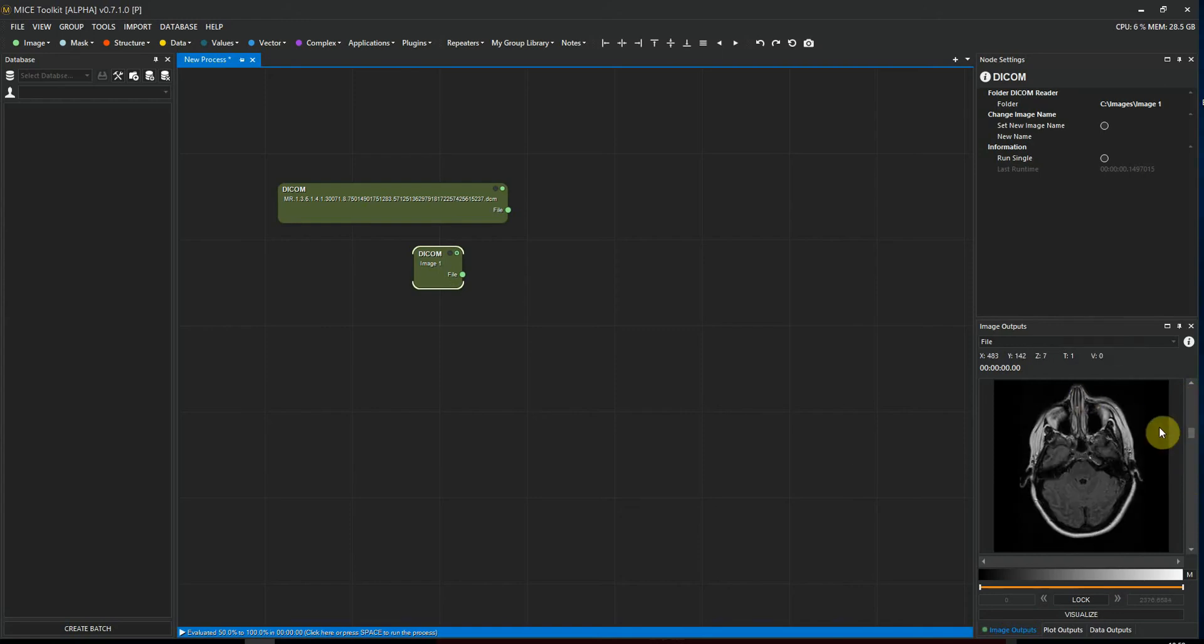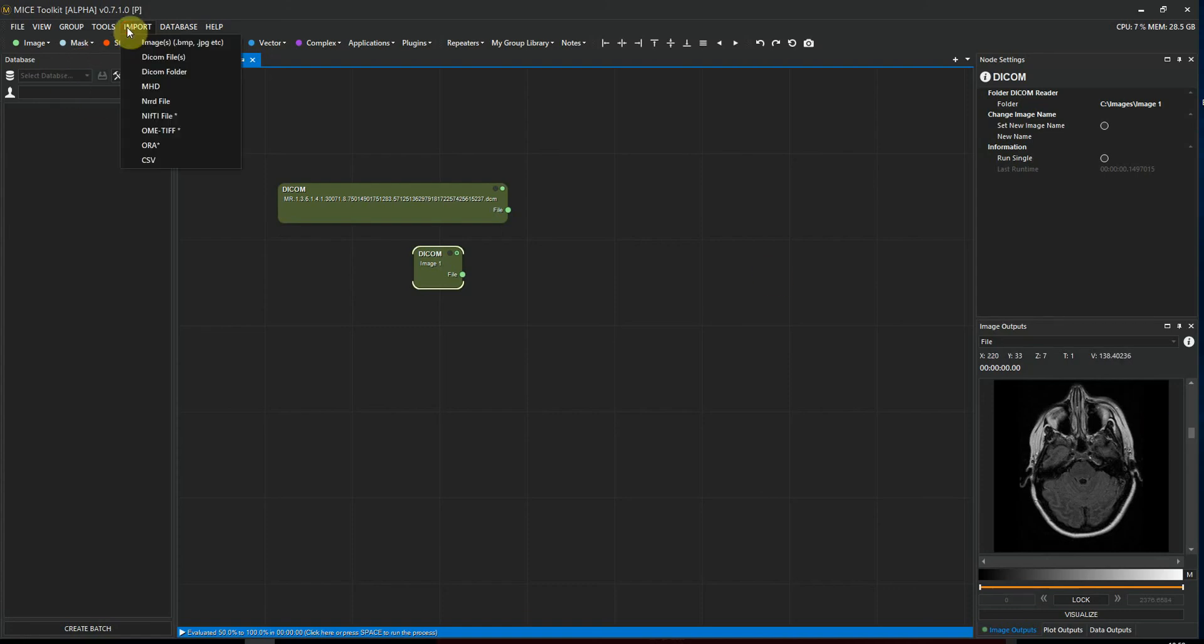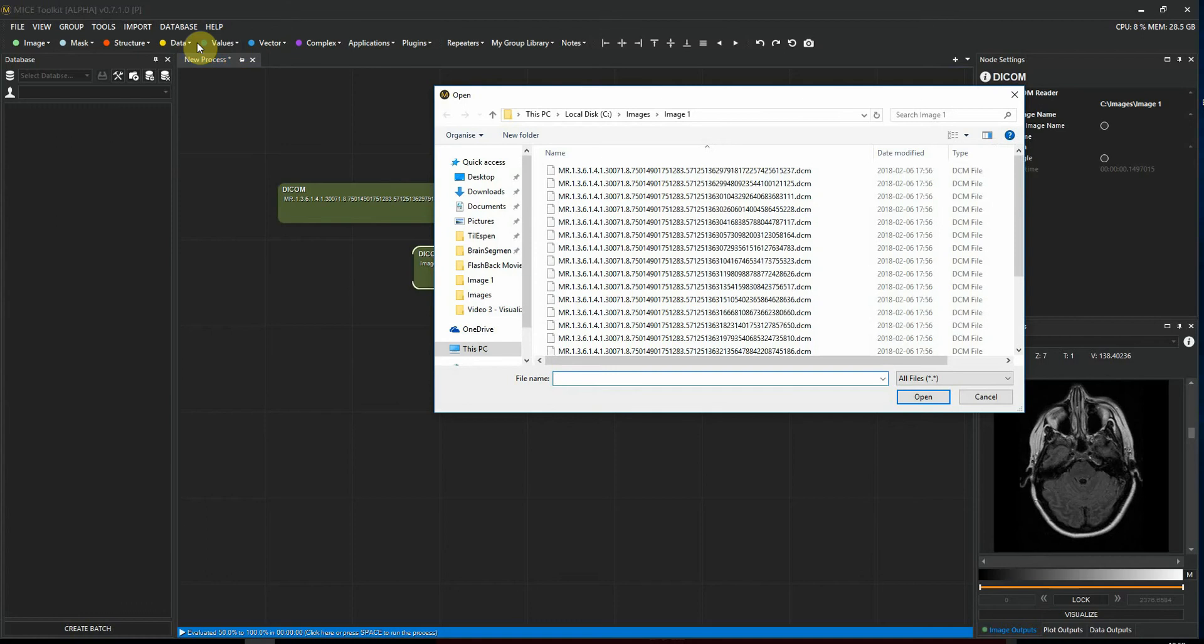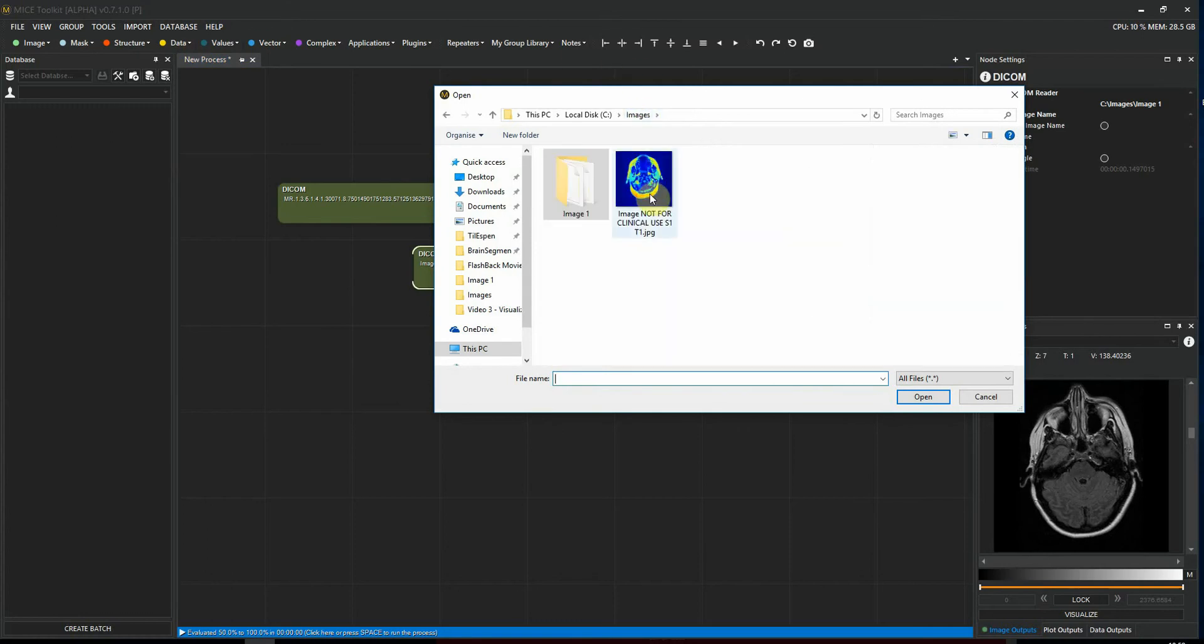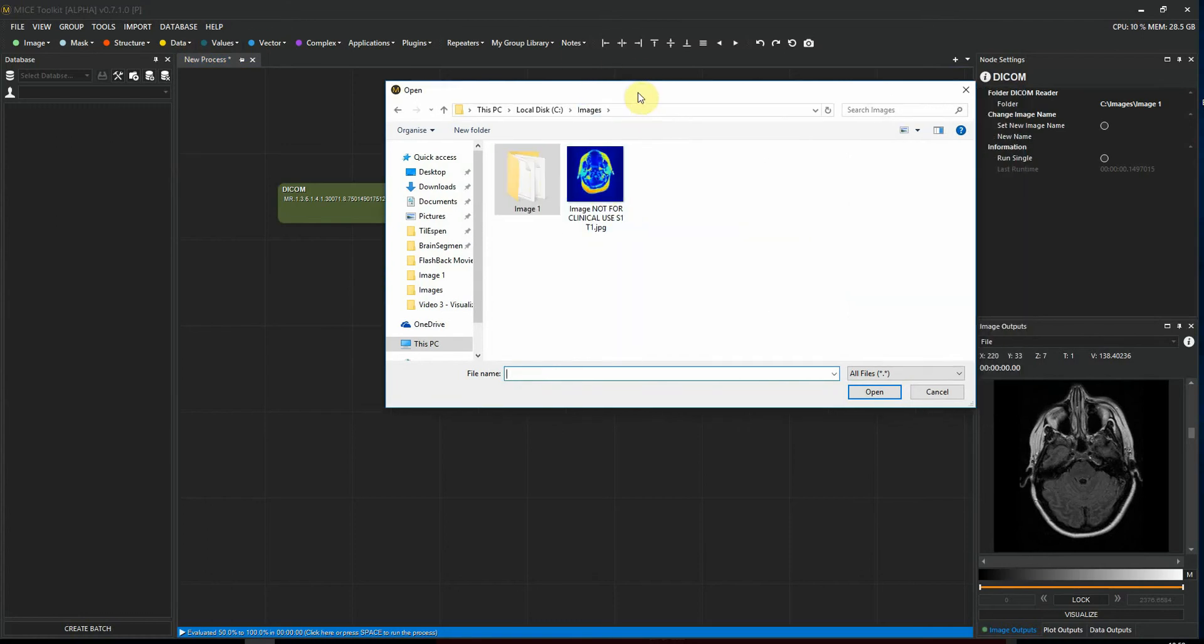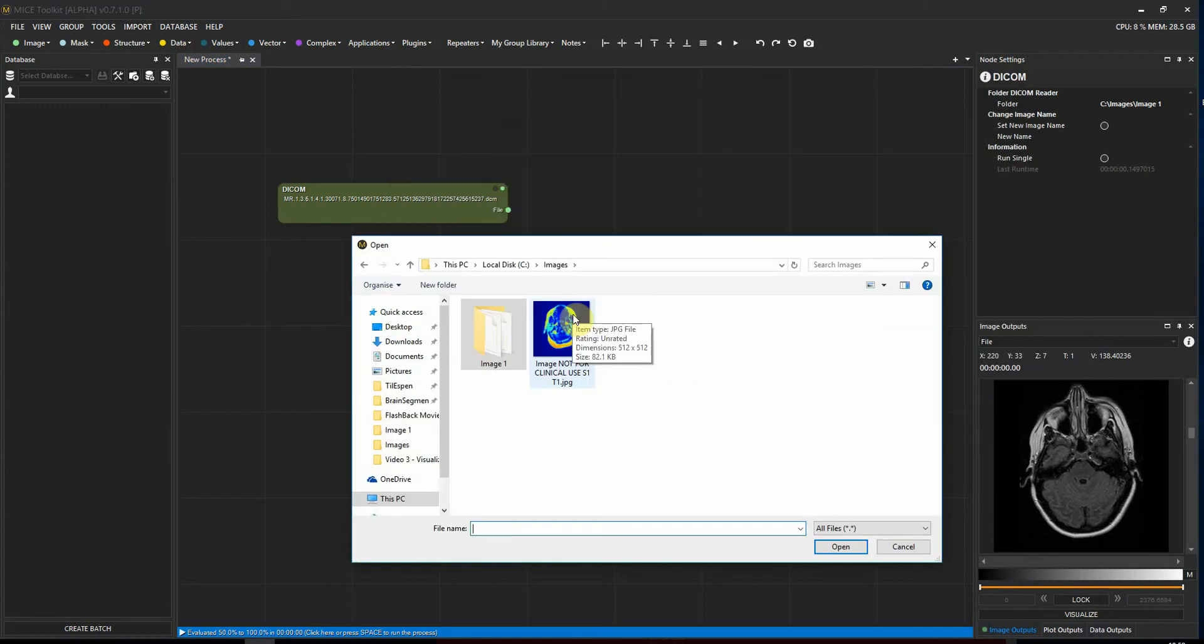Finally, I want to show you how to import a JPEG or a bitmap. We do that by going to Import and selecting Images. Here I have already exported the JPEG version of the slice that I imported previously, and I exported it using a different color map. I select that one and I click Open.